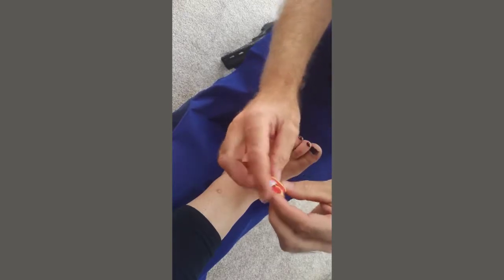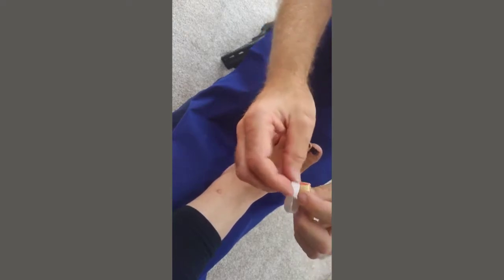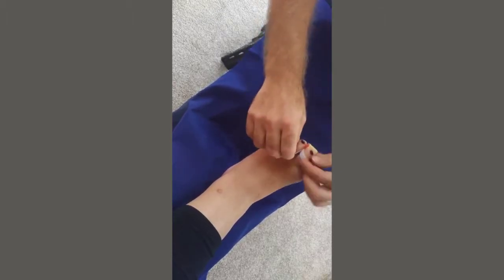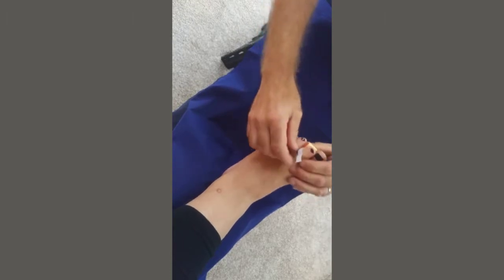We also have a foam roll — that's what gives you the ability to straighten up any clawed toes. The idea is that it goes over a toe, and you pull the strap so it's firm.